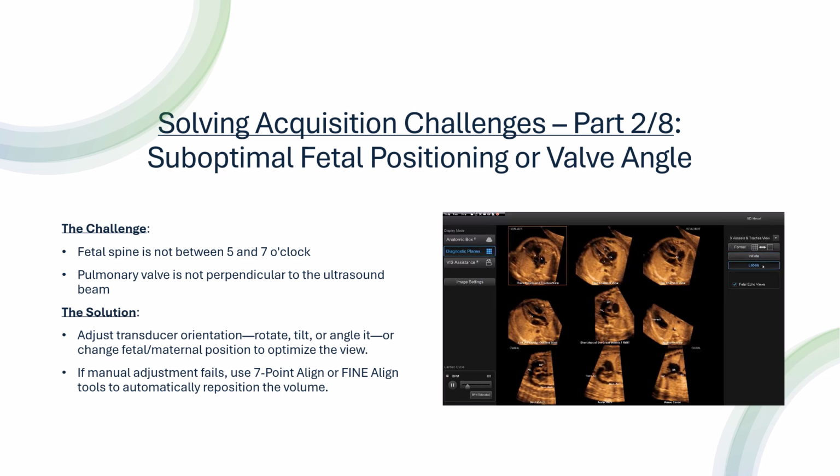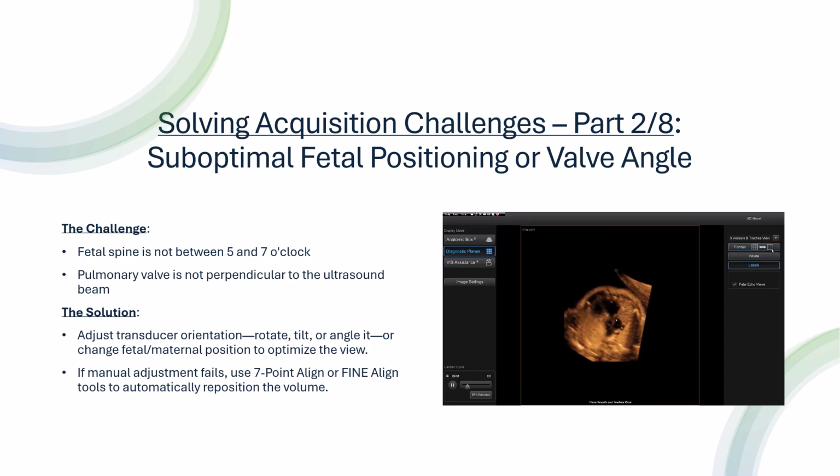As you can see, beautiful 9 diagnostic planes. The pulmonary is fine, the 3-vessel tracheal view. And this is the 4 chambers view. Looks nice.